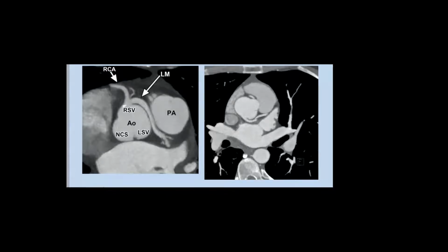Is it better than invasive angio or not? Yes, better. Invasive angio shows you the arteries without showing you the entire anatomy and the relationship, so you have to hypothesize about the course.